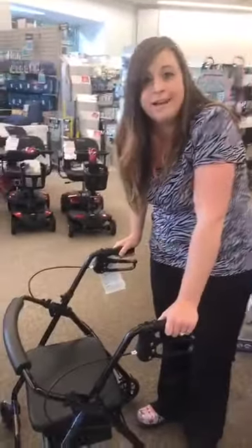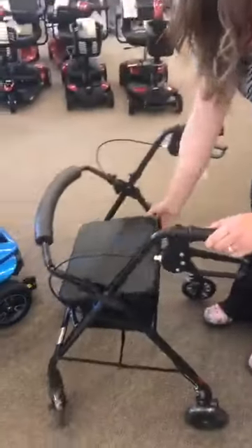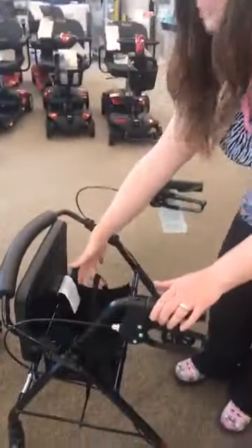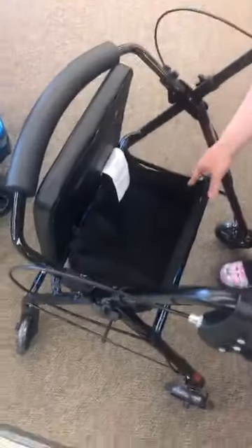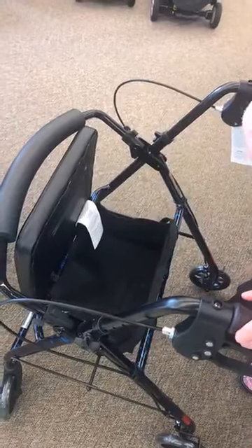Another thing I want to show you guys is how to fold these. We're often asked this question as well. Most of these fold exactly the same way, again, no matter which brand you get. So when you lift up your seat, there's a couple of different ways that this could work. Some of them have actual straps that come over your baskets, whether you have a cloth basket or metal basket. The biggest thing, if you have a metal basket, you're gonna have to remove that. You can't fold it with the metal baskets in there.